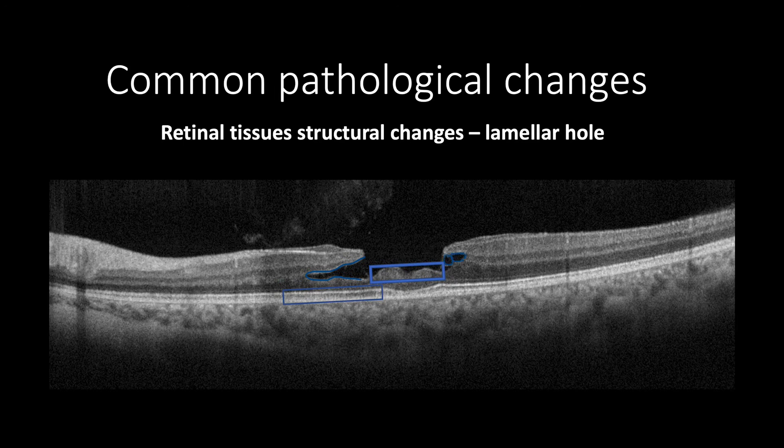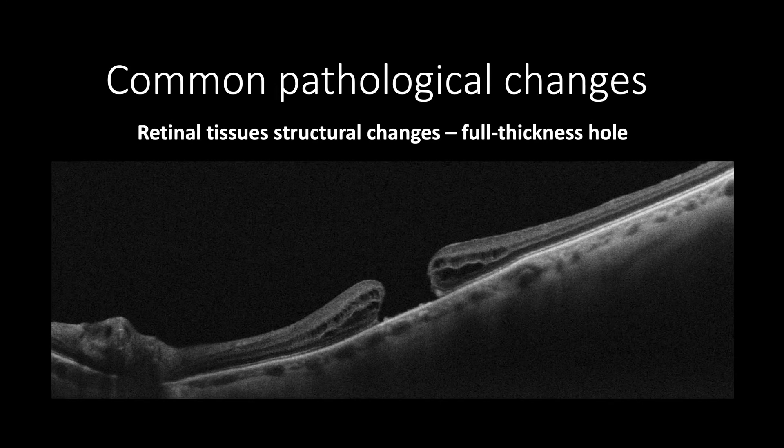In contrast, full thickness defects will feature a full thickness macular hole. In this case of stage 4 full thickness macular hole in a myopic eye with RPE drusen-like changes and cystic formation in both edges of the hole.